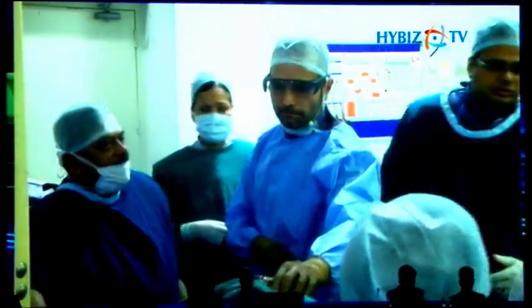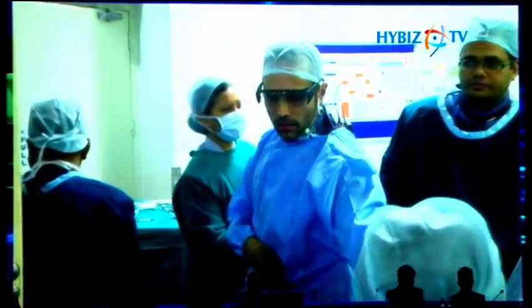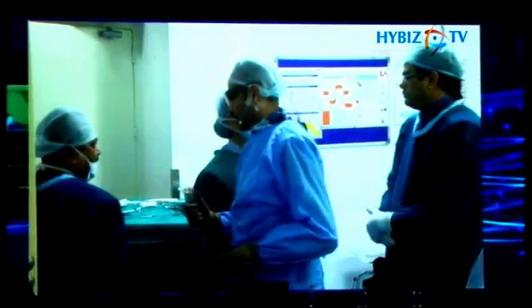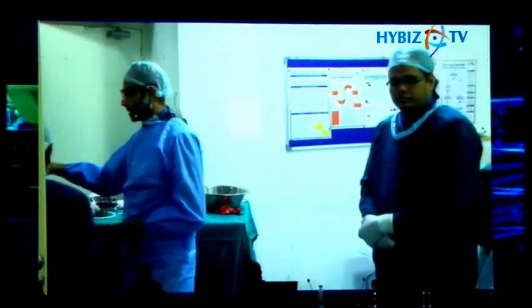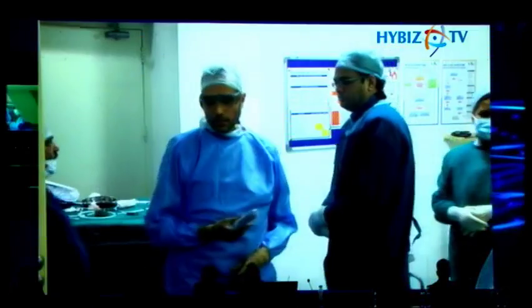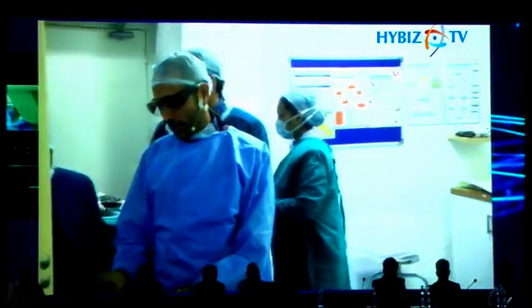Arun, you always wanted a tougher wire to be there before the Stingray is taken. Correct. Which are the wires you prefer? Miracle 12 then? Miracle 6 or 3, something stiff all the way to the tip, Gaia, CP. Gaia first is also okay, or Gaia second? I usually, if I'm going to use the Gaia, I end up using third. I need something with a Luer lock.